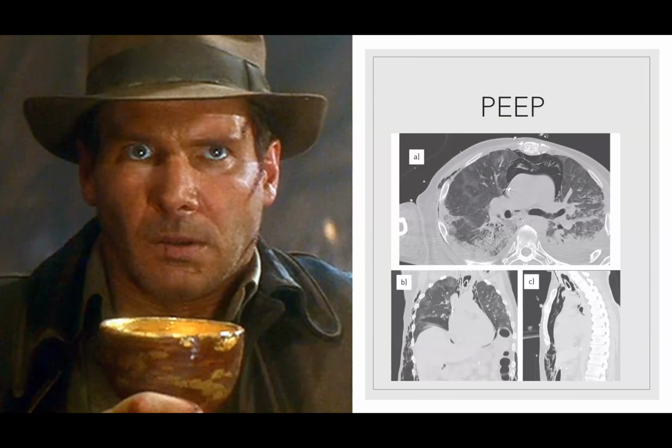So what we really have to think about is that this is a dynamic process. These lungs change every day. So how can we meet that? Now, there are a number of ways to do it. And the standard that was established in the LOVS and ALVEOLI trials, and I think is still in our RT books, is the two types of PEEP tables.